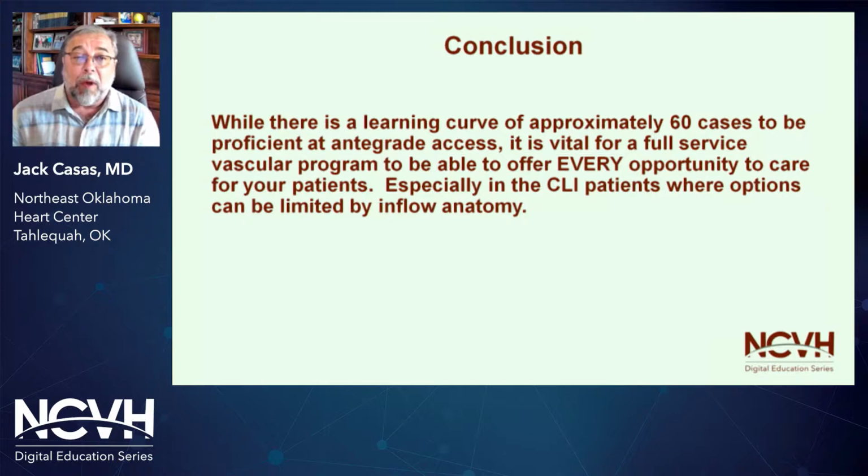So in conclusion, while there's a learning curve of approximately 60 cases to be proficient in antegrade access, it is vital for a full service vascular program to be able to offer every opportunity to care for your patients. And what I mean by that is having the standard retrograde access, if you need to come from a brachial radial approach, antegrade access, retrograde access from distal circulation in the popliteal, or pedal access.